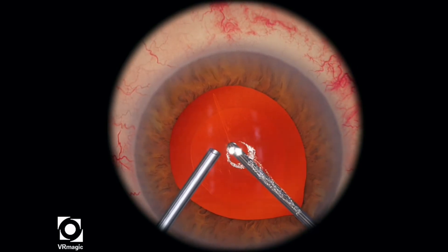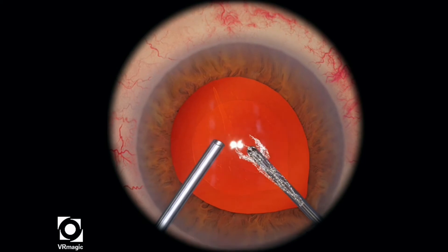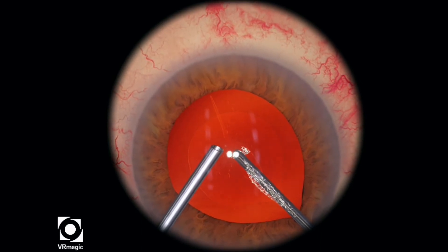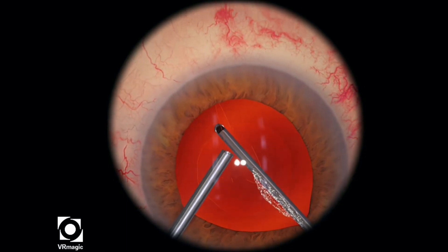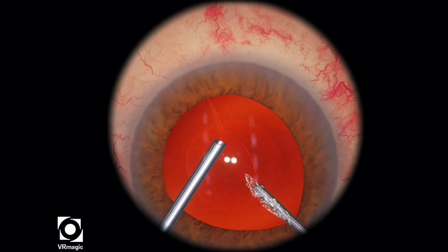If you don't do that, then you're going to tug on the anterior vitreous and bring it into the bag or the anterior chamber, and then you'll lose a lot of points. So stay behind the posterior capsule, clean up all the vitreous first, and worry about the other stuff that's coming towards your port later.